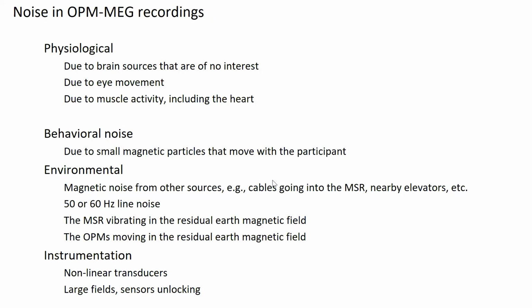There's actually not that much difference between the type of noise artifacts that we have with SQUID MEG and with OPM MEG. So the physiological noise is the same. The behavioral noise, the participant wearing something metallic that moves, is the same. But now one of the additional sources of noise is that the OPMs can move in the residual Earth magnetic field. And that's, of course, a great advantage of OPM, but it's, of course, also something that we have to deal with.